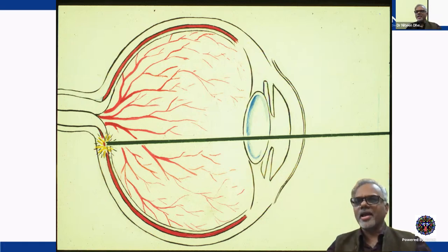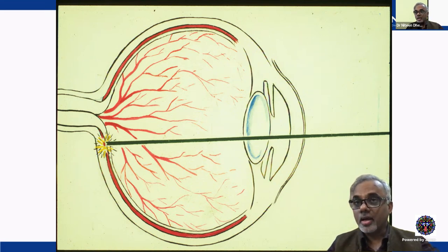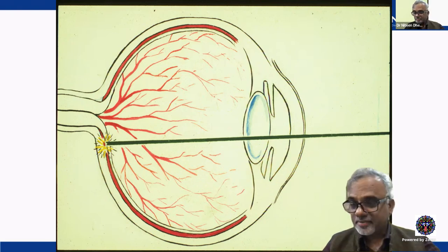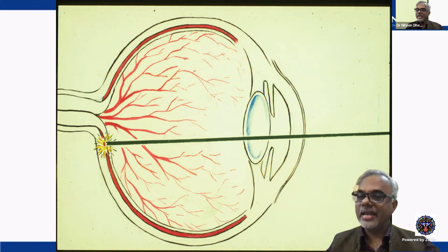So how can a light stop and sit on top of a transparent subject, and how can the same light with a different wavelength go inside through and through and make heat, coagulation and burning there? This is nothing less than magic. That is why medical lasers are so special, and this specialty of the laser comes from the selectivity.